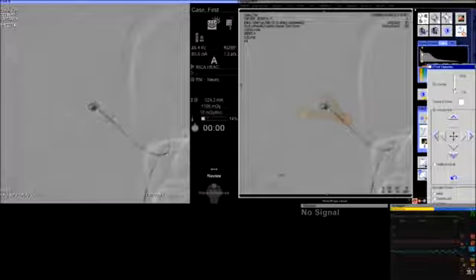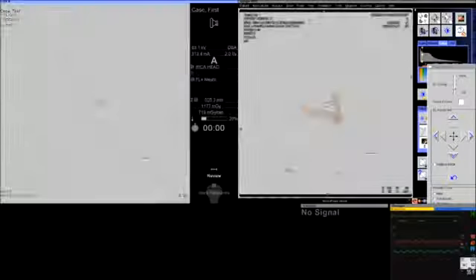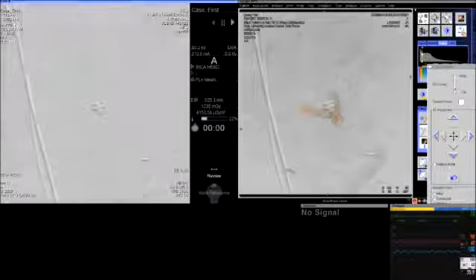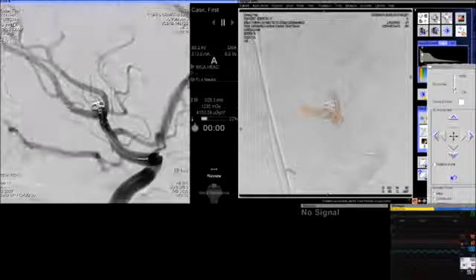and it's undersized. And I think the idea of undersizing is we have significant protection at the neck of the aneurysm. I want this to be as easy as possible to place these coils without a lot of pushback, without having to have the microcatheter go in and out of the parent vessel. I think that it's very important now that once you get access to the aneurysm, your microcatheter stays there and you're able then to place all the coils inside of the aneurysm without having to manipulate the catheter too many times.